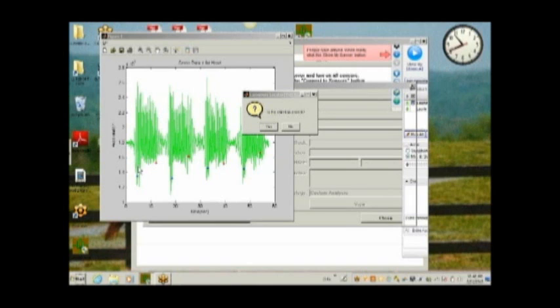The raw head acceleration will be displayed, and the first question asked of the user is, is the selection correct, yes or no? Data to be analyzed will be indicated between blue and red stars. How this selection is determined is by the right front gyroscope sensor. The gyro sensor calculates a median stride rate.